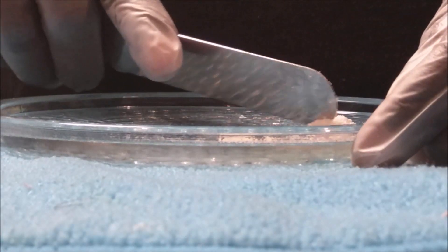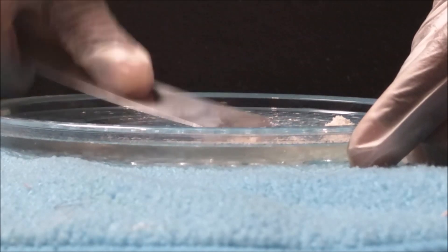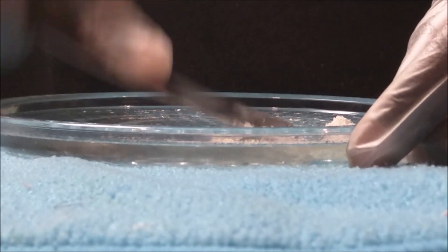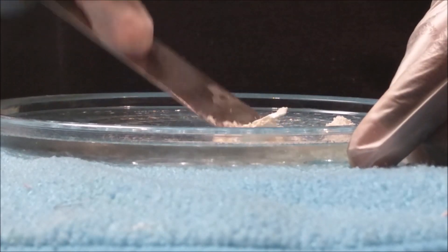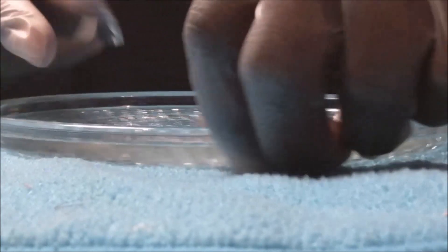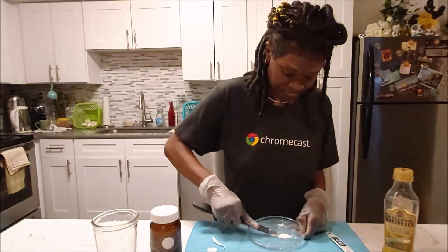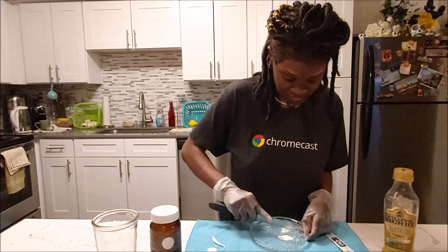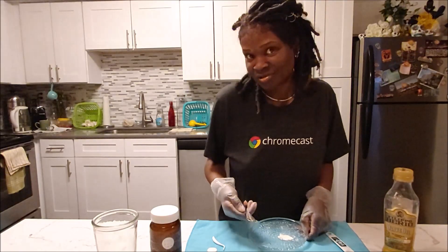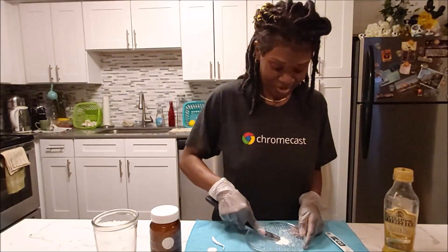I need to put a little bit more in, so you add the zinc powder in slowly, because you don't want this to become crumbly. And so it's almost done. Make sure that you have on some gloves because this is a real messy, messy task. I'm going to put the rest of it in here. I may have dropped down more than two drops of oil, so it's going to take all of the powder. This is like kneading dough for some bread.